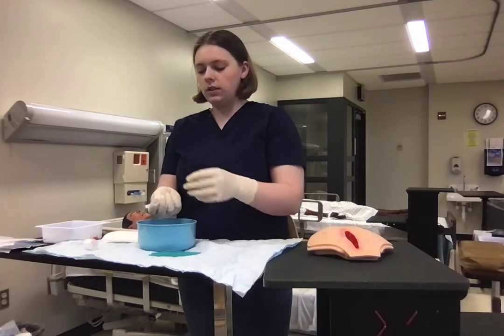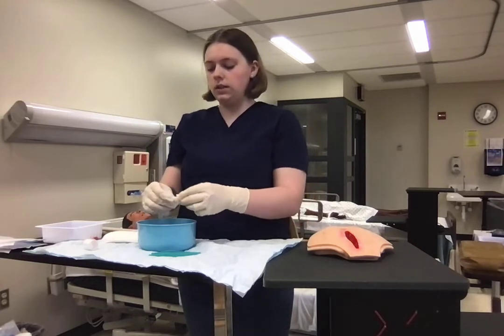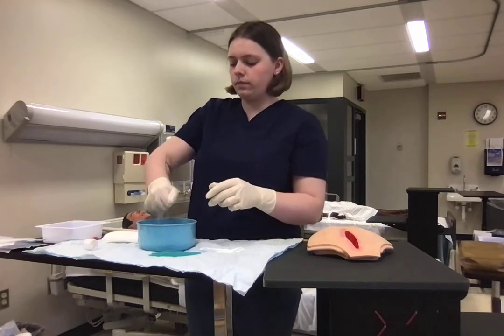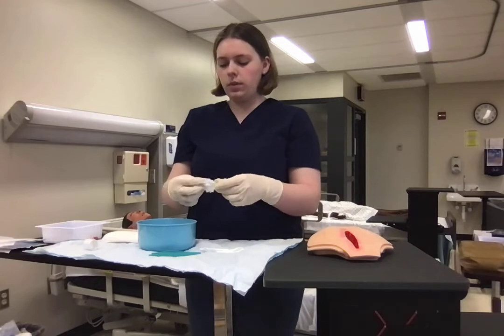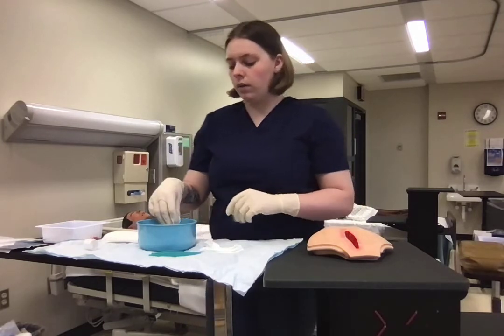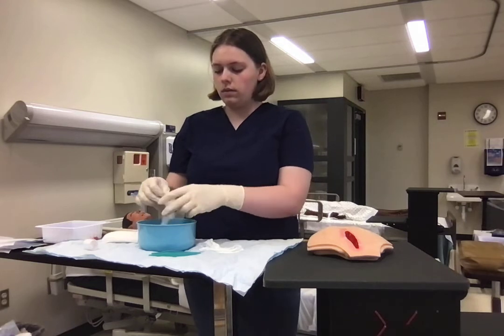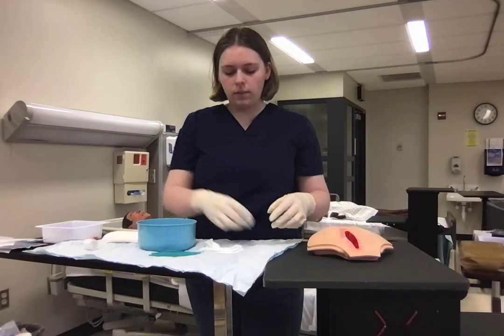So I am able to touch the gauze because I am wearing sterile gloves, maintaining sterility. So I'll set 1 to the side for packing, and then another. I'm just going to roll those up. Alright, and then I'm also going to wring out my remaining 3 for cleaning because we don't want them to be too wet as they are cleaning the wound. Also going to set these on my sterile field.